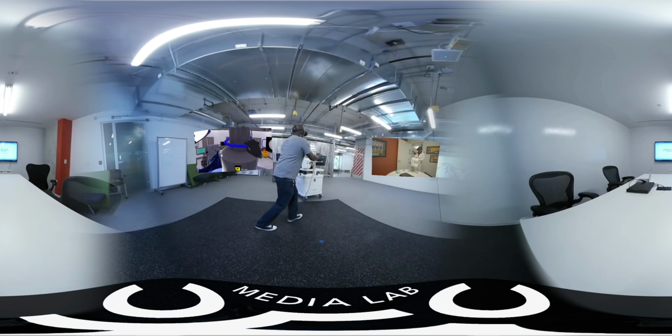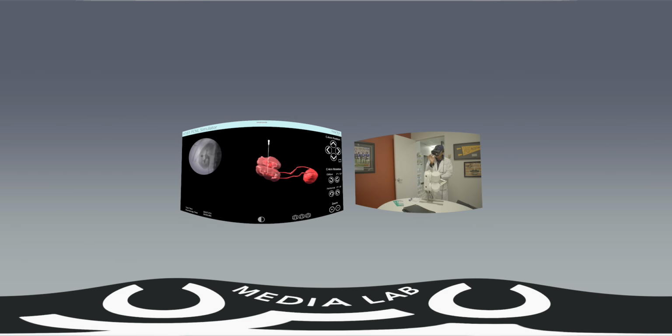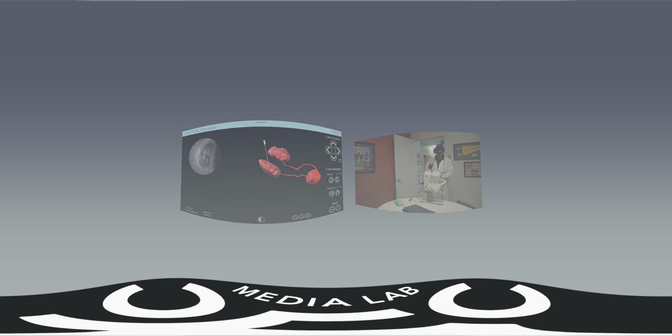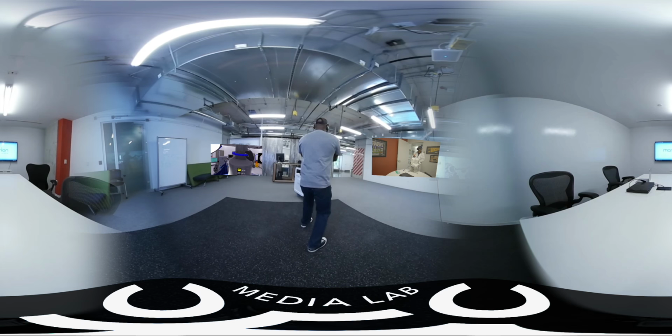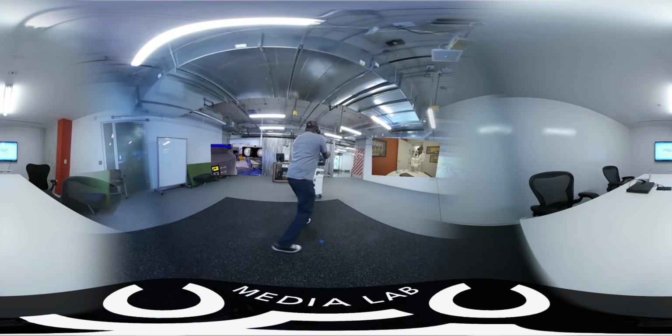So I'm going to take that and just push it in. That seems about right. You can see it's almost just a dot on the image. So we've got our needle. The next thing, obviously, is we're going to take a wire and I'm going to feed it. Again, I need the x-ray to tell me where my wire is going. So I'm going to take that wire and thread it through my needle.